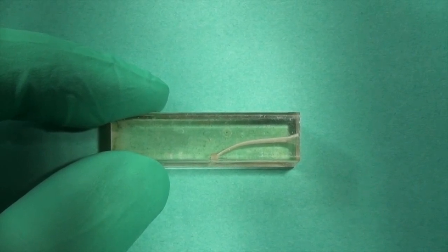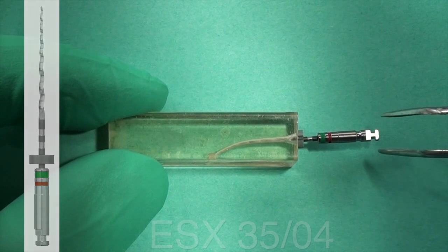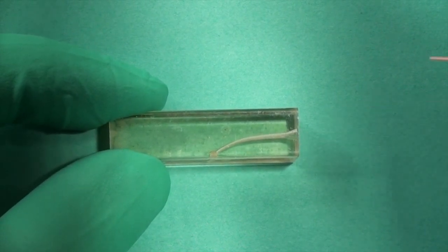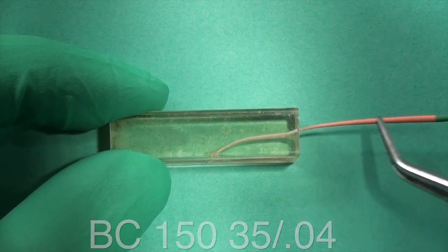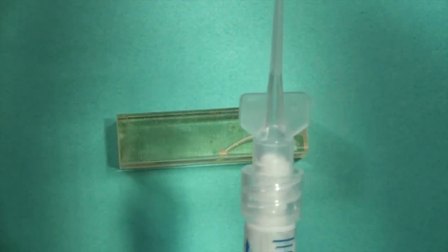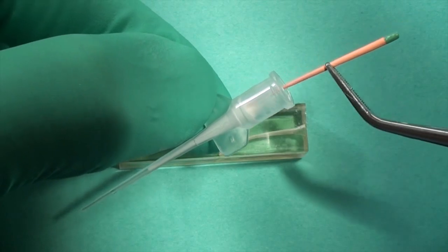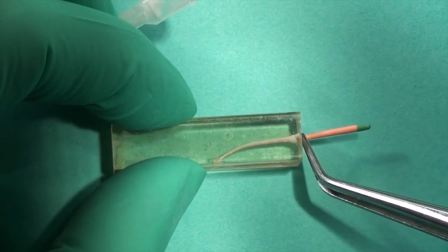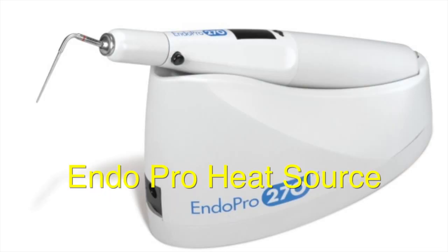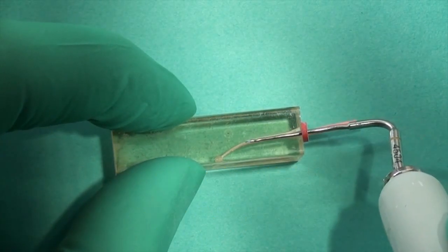This is a plastic block already prepared to a size 35 ESX file. This is the master file, a 3504 ESX file, and after removing it we fit in a corresponding size BC 150 size 35 gutta percha point — a matching 04 taper point. I'm using an Endosequence syringe dispensing tip, injecting a little bit into the tip and then coating the cone homogeneously all around. Now I'm seating the cone all the way down to the full working length with a couple of pumping actions.